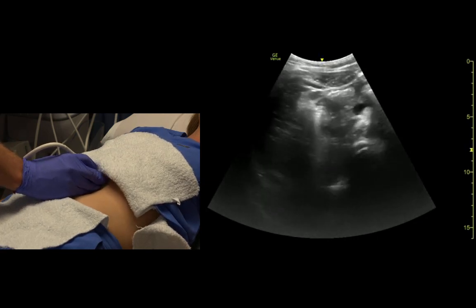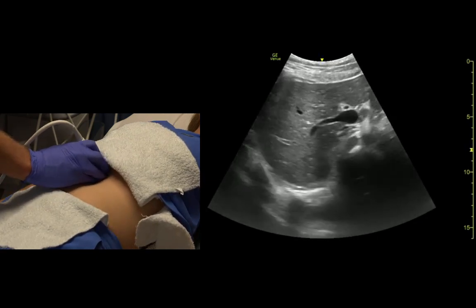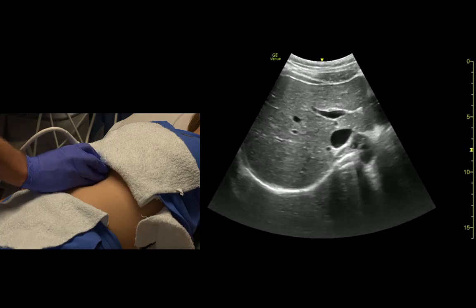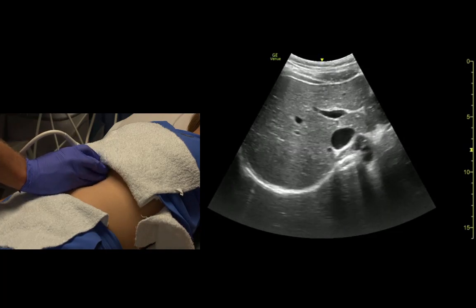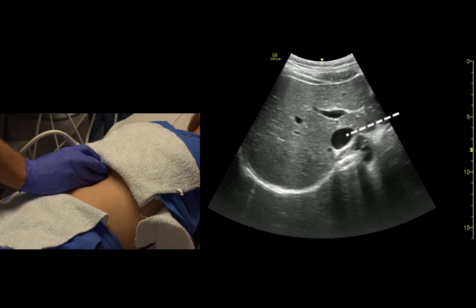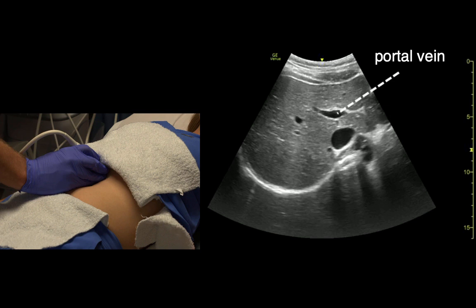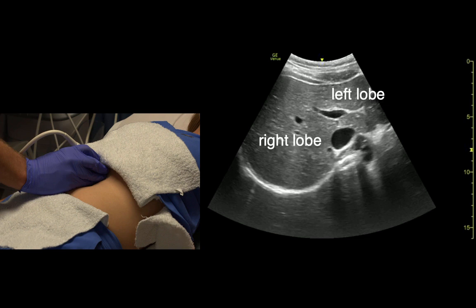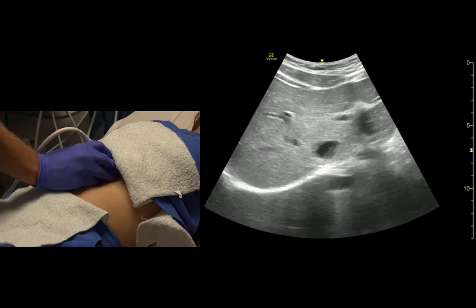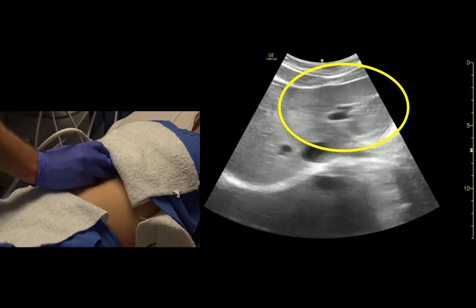I'm going to ask her for a big breath and hold. So that's all liver there. We see the diaphragm in the back, the inferior vena cava, and the portal vein. It kind of divides the liver into right and left. This is all left lobe over here.